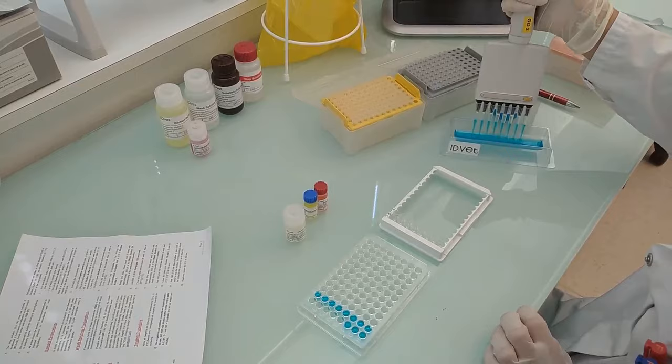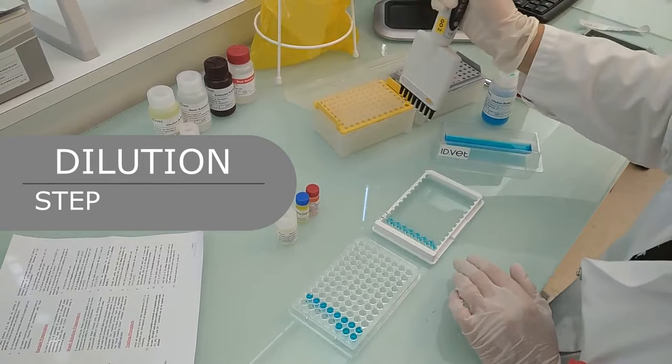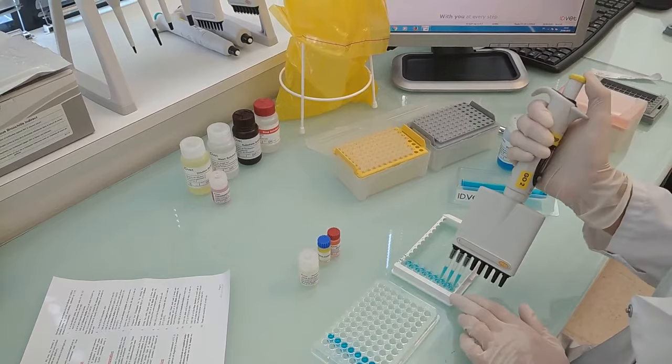Dilution step: In the ELISA microplate, add X microliters of dilution buffer 14 to as many wells as there are samples to be tested, not to control wells A1, B1, C1, D1, and E1 if necessary.